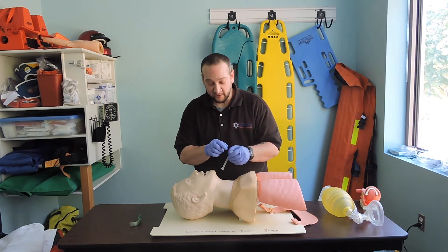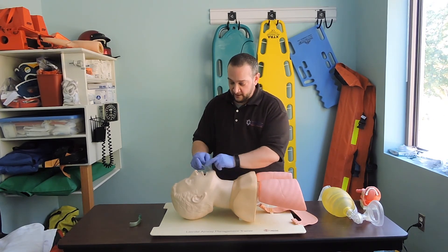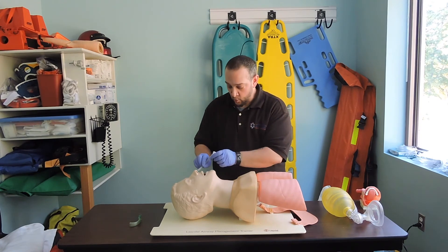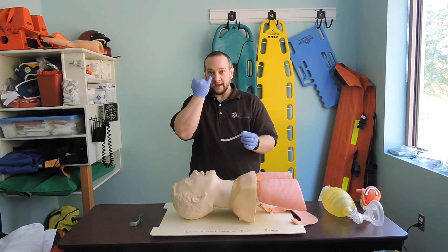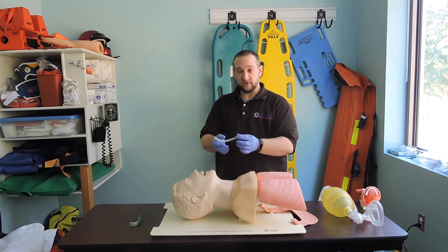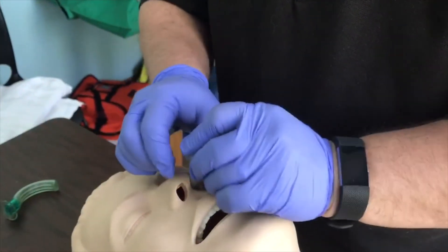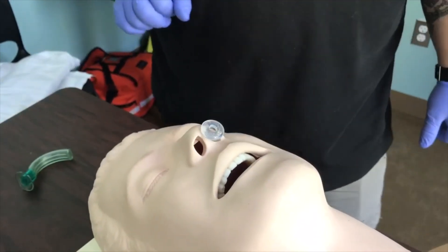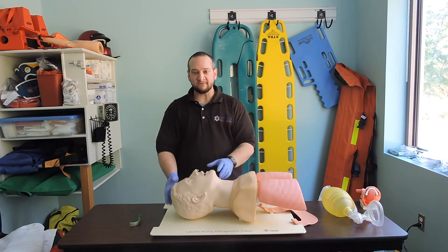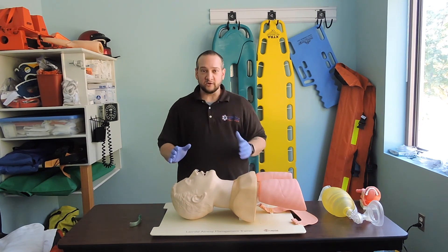For the NPA, we always point the beveled end towards the septum — the deviation in the middle of the nose. We have two nares on either side. Because this goes up through the mucus and turbinates of the nose, we make sure it's well lubricated — always use a water-based lube. It goes in using a twisty-turny method and guides until the trumpet sits flush with the nares. I can use one NPA, two NPAs, or two NPAs and an OPA — whatever I have to do to secure this airway.